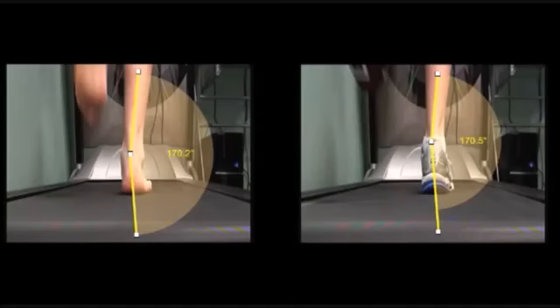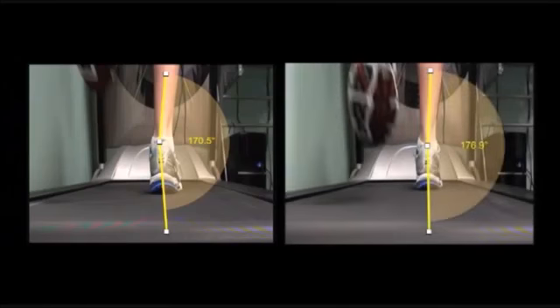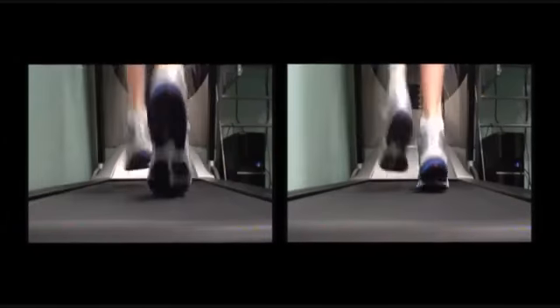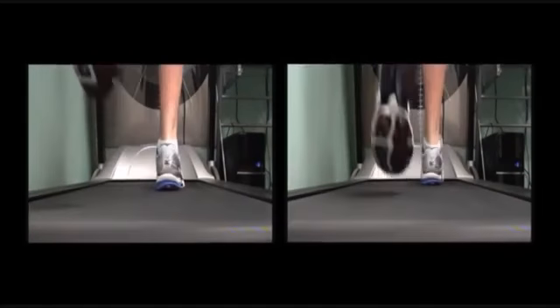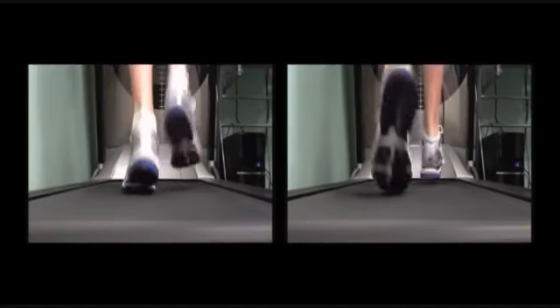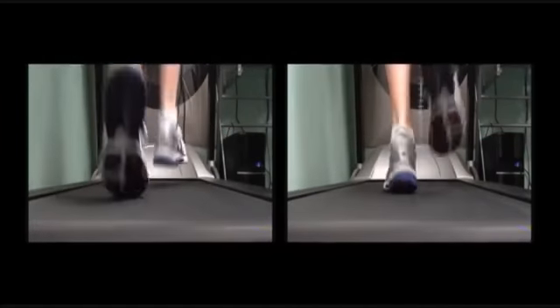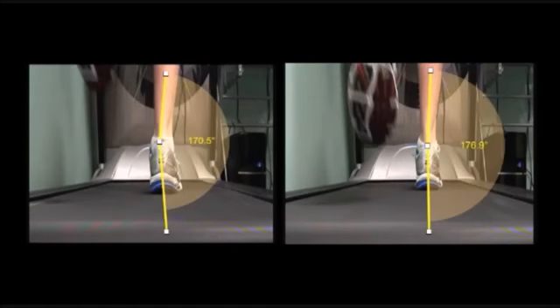Now let's customise the shoe further by adding one of our inner soles to work with the shoe to help limit overpronation. You can see here that the shoe with the inner sole fitted has improved the foot position more so than the shoe alone. Our inner soles were able to control overpronation to within normal limits without overcorrection or irritation. It's the subtle differences with our inner soles that have helped us to achieve these results.